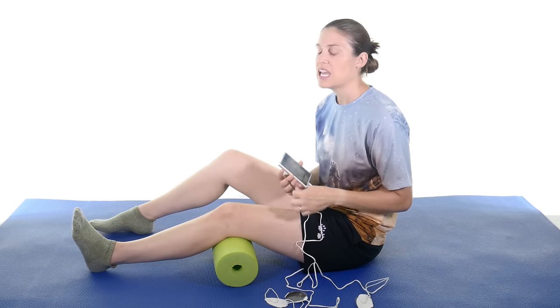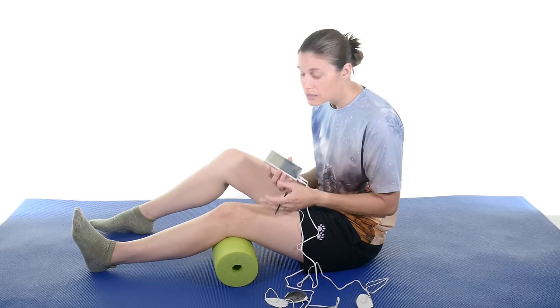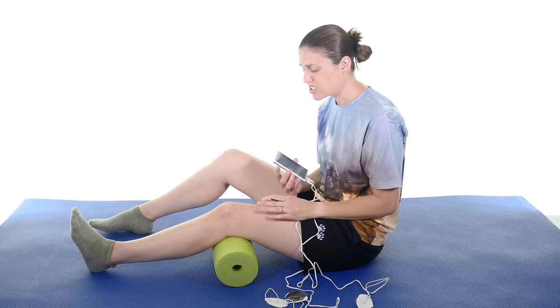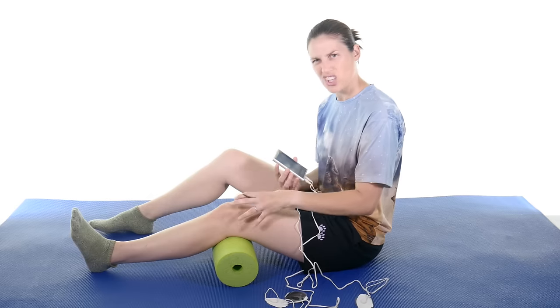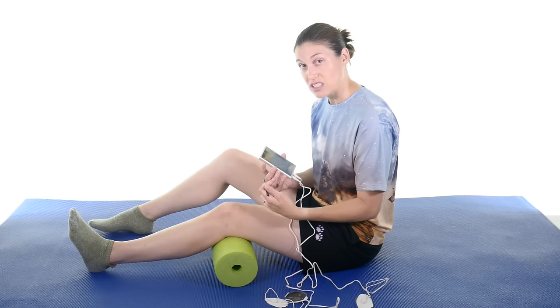TENS is for pain mainly. TENS stands for transcutaneous electrical nerve stimulation, which basically means the nerves on the top surface. So this isn't a muscle contraction — you don't want to see a muscle contraction. Sometimes you'll see a little quivering with TENS, but if you're actually getting a contraction, you're not quite doing it right, because this is to get the pain to go down. In theory, what it does is the vibration you feel through the TENS unit follows the same pathway as the pain pathway and kind of cancels it out. So it's a great way to get some of that pain down so you can do the stretches and exercises you need to get better.